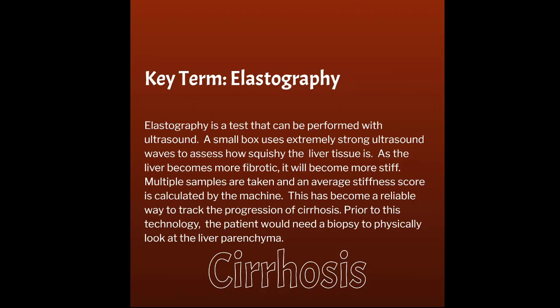So we take multiple samples using elastography. Again, it uses a lot of ultrasound energy. So usually when you do an elastography study, you send the beam out. It gathers the information that it needs, and then you actually have to wait 2 or 3 seconds because you don't want to keep blasting this one area with ultrasound energy. So you wait a couple seconds and then you can send another sample out. Not uncommon to get like 10 samples, and then you take the average of those samples, and that is compared to a chart, which tells us how stiff the liver is.